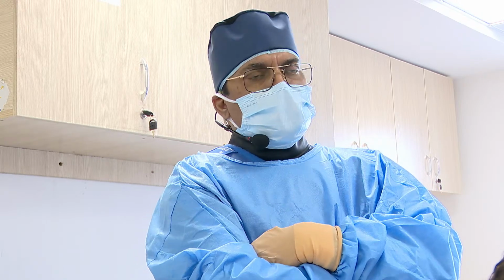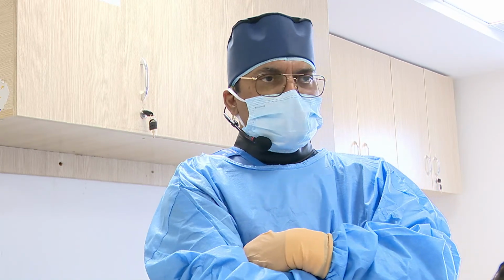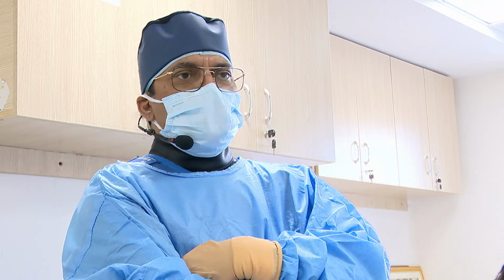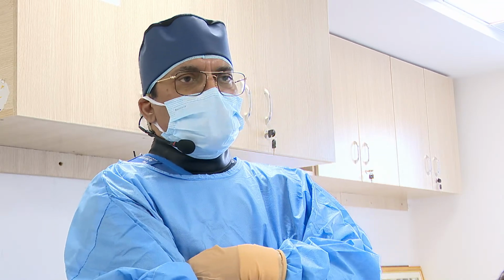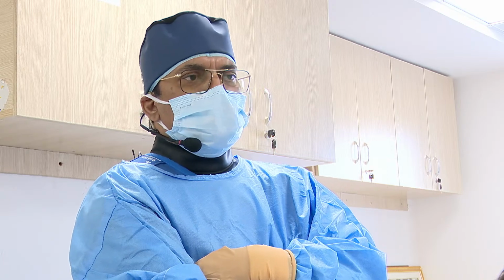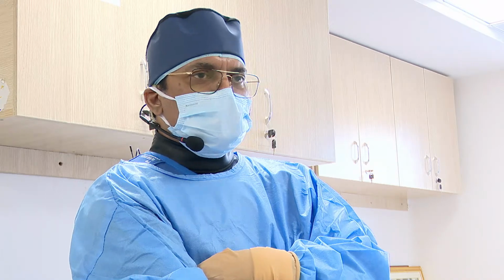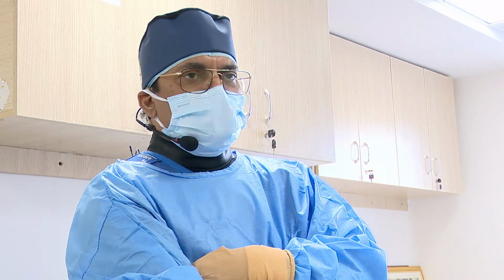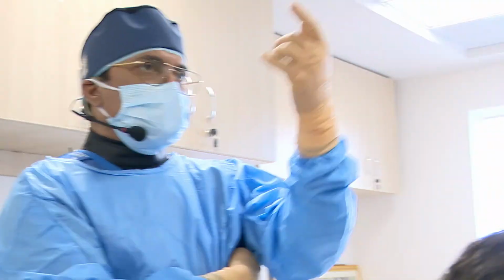And under expansion, whether there are any issues, and at the same time rule out any medial edge dissection and see if there is any geographical miss or not. If those are there, we'll try to address them, and finally we'll end the procedure with image guidance. So if anything is there, then we'll proceed with the case.